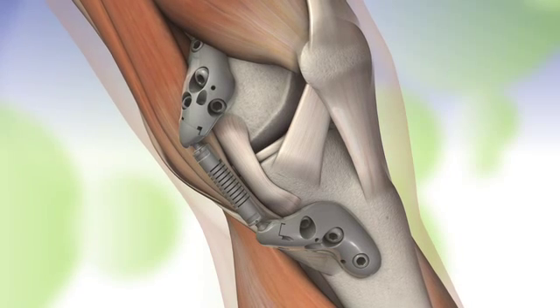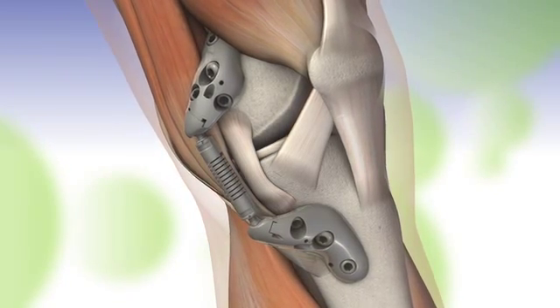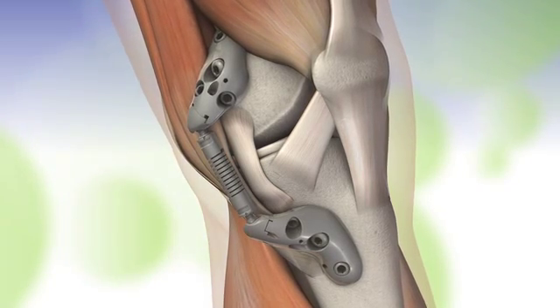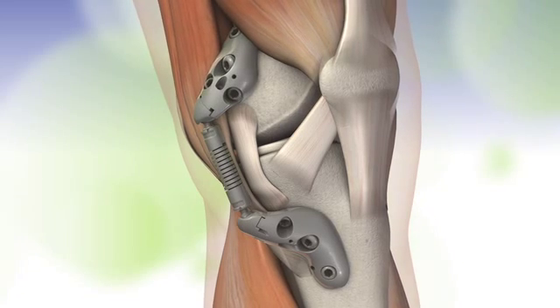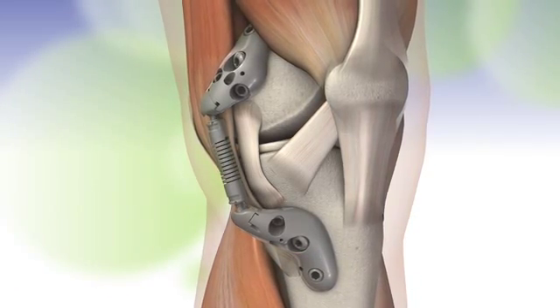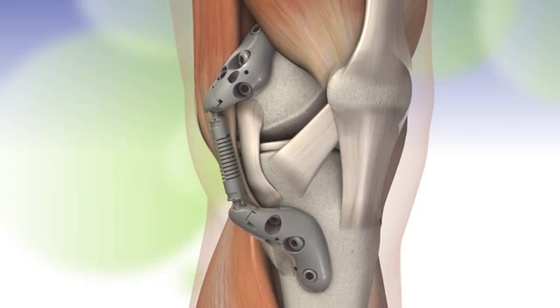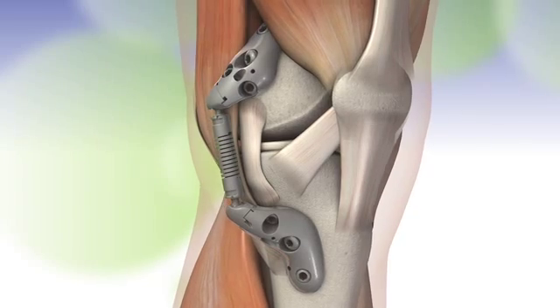Using small incisions, the Kinespring system is positioned alongside natural knee structures under the skin and outside the joint. This requires no bone, cartilage, or ligament resection. The Kinespring system supplements these important anatomic structures, allowing natural knee motion while providing pain relief.